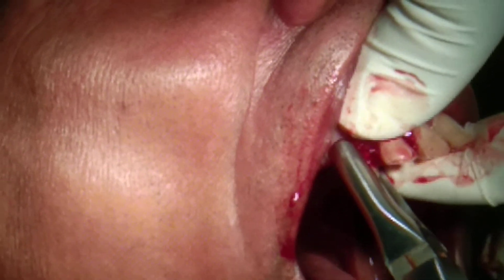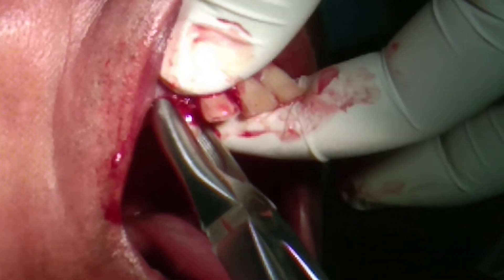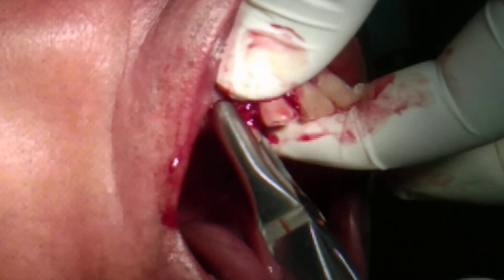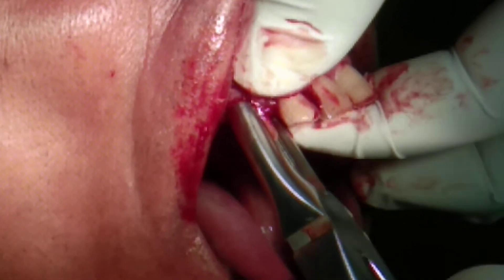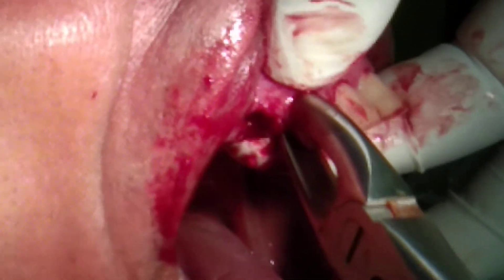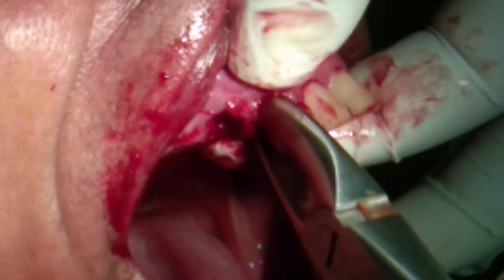Canine will have a long root, so you have to be very careful about it. Again, figure-eight motion — and this is comparatively easier.